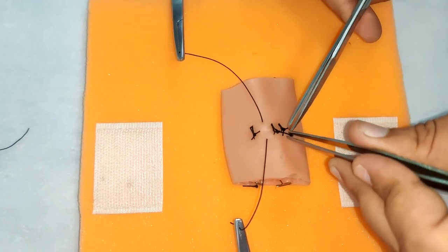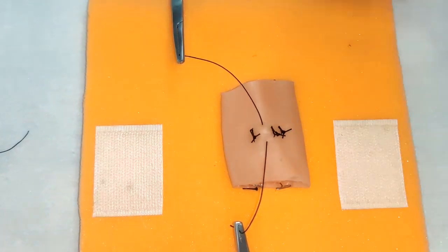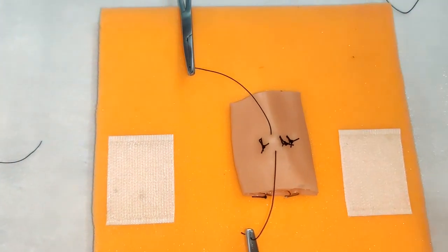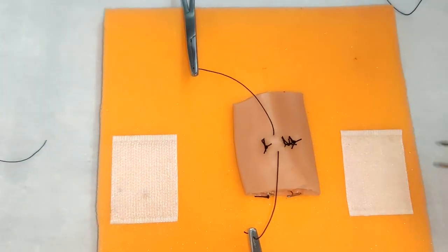Unlike the previous technique, we do not need to take a blind suture. Instead all sutures are taken under your vision.